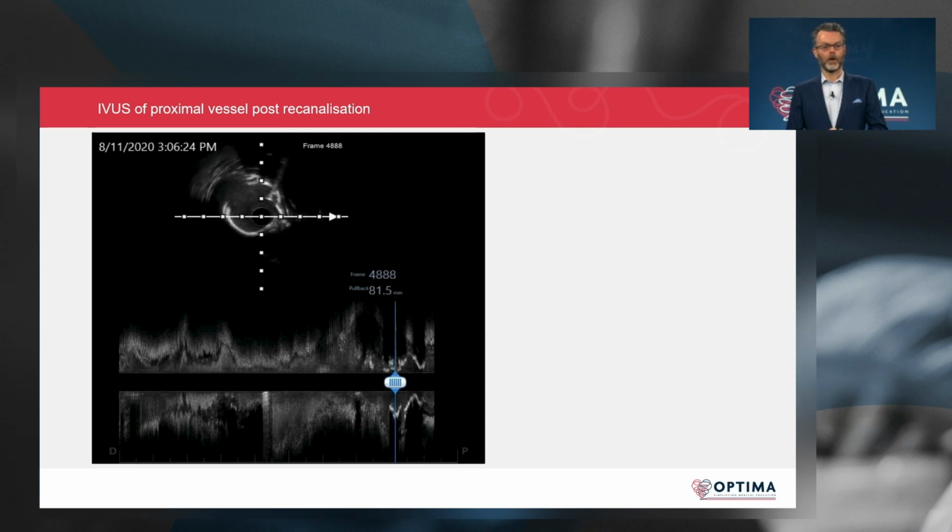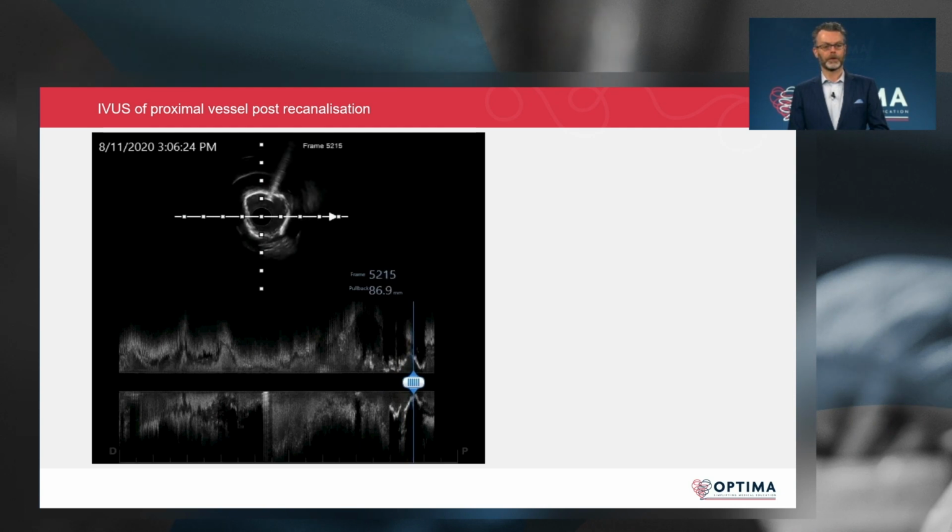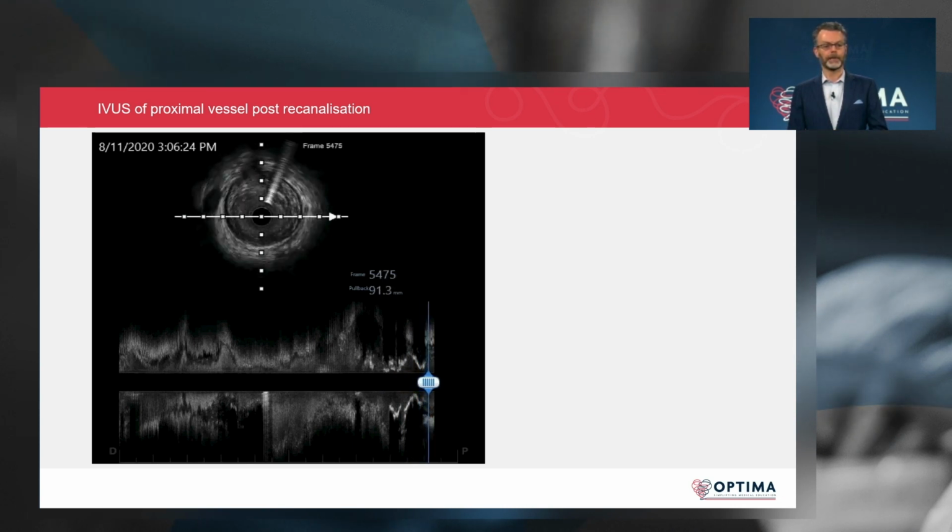And here you've got an almost circumferential or 360 degrees of calcium with failure of penetration of the ultrasonic waves beyond the calcium in the proximal vessel, before it moves into a slightly larger, again, more totally concentric calcium here, no suggestion of any fractures whatsoever, and then more proximally into a large vessel with more fibrotic disease.